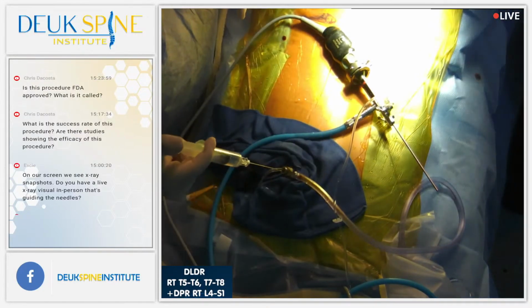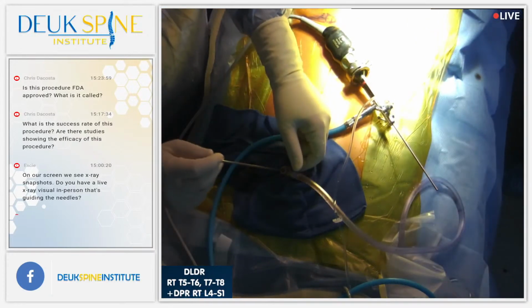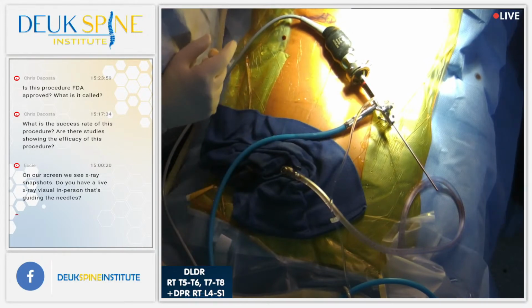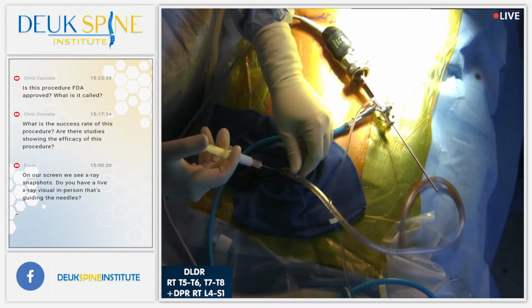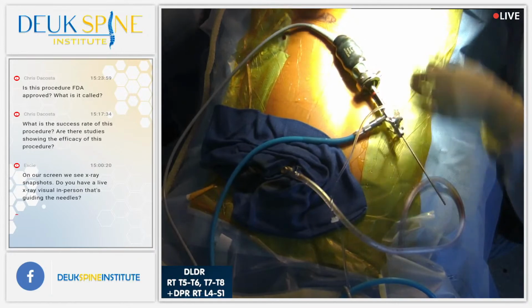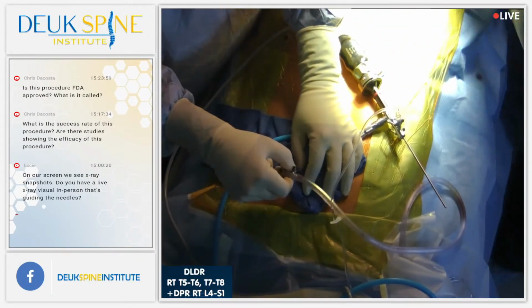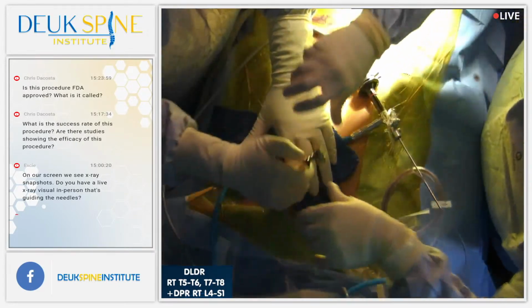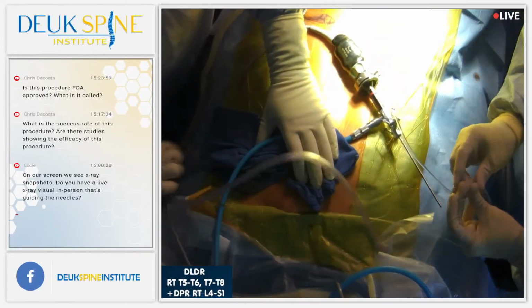The pain nerves to the facet joints are called the medial branch of the dorsal ramus. It is a small nerve branch that comes off your nerve root as it exits the foramen. And it sends a nerve backwards towards the facet joint. And that's the nerve that all the pain management doctors are trying to treat by rhizotomy. They use an RFA rhizotomy. We don't do an RFA rhizotomy. We do a plasma rhizotomy, which is a new technology we developed here. And the plasma is more powerful.